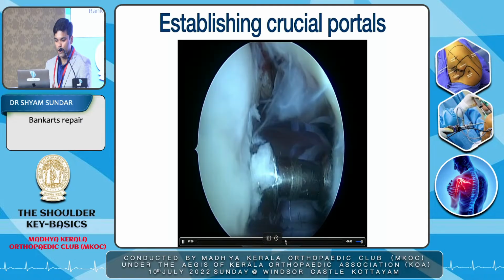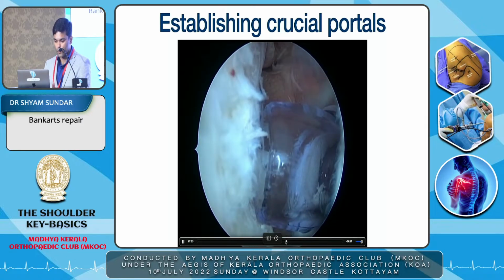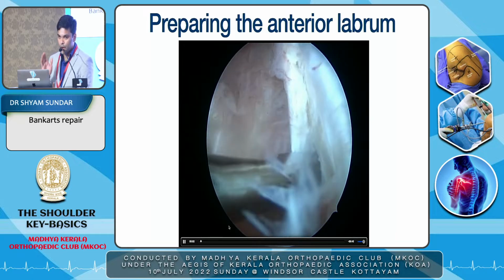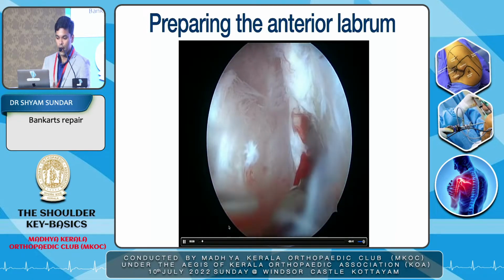Once that is done, I go for the remplissage procedure. I put the anchors and take the bites. I'm not going to explain that here. Then I'm viewing through the anterosuperior portal. My working instrument is from the anterior portal.